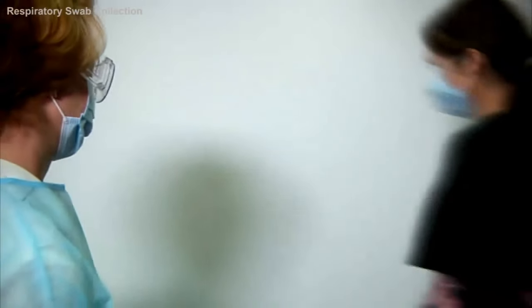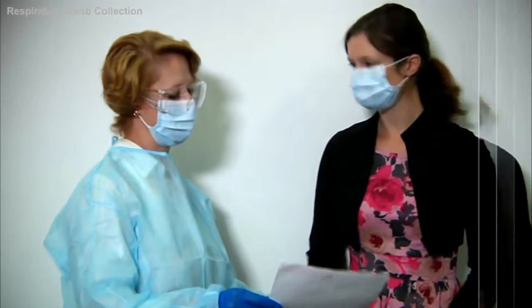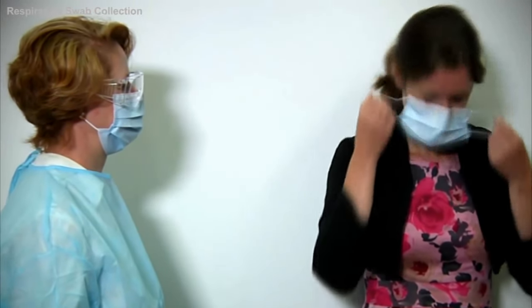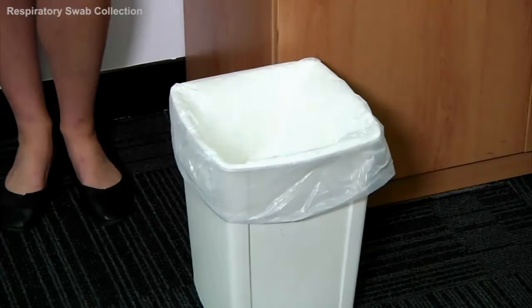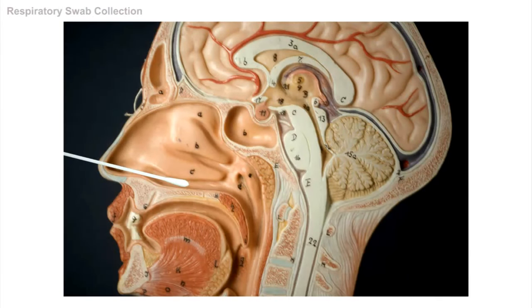Now, with the personal protective equipment on, you're ready to take the swabs. Perform an identity check with the request form that you've just filled out. Ask the patient to remove their mask and dispose of it properly, then ask the patient to rest their head against the wall or the back of a chair. To ensure a good quality specimen, collect epithelial cells from the nasal septum and pharynx, and avoid nasal secretions and saliva.